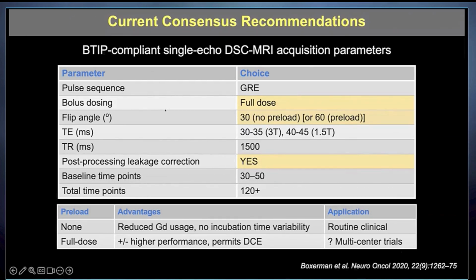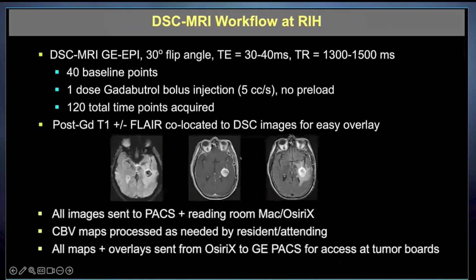Now, one can also use a full dose preload that would also permit simultaneous acquisition of dynamic contrast enhanced imaging, which we're not going to discuss in this forum, and this protocol may be useful in multi-center trials.